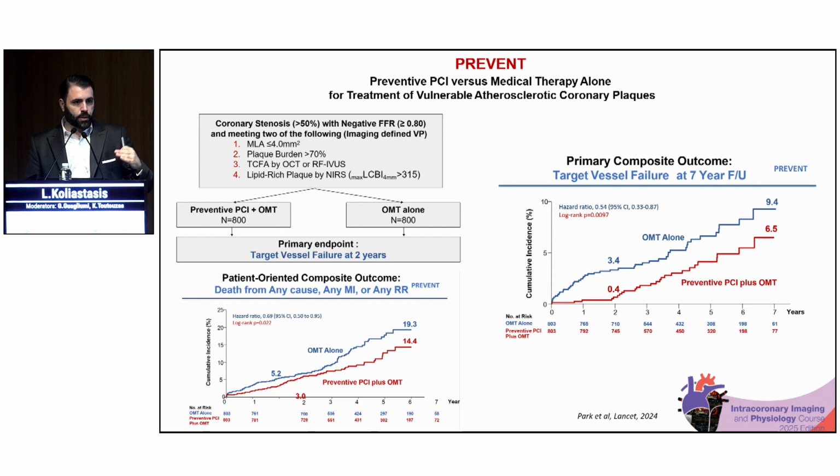Of course, we should keep in mind that almost half of the patients were treated with the Absorb platform, the bioresorbable Absorb platform that was removed from the market in the middle of the trial, and that's why the investigators changed to drug-eluting stents after the removal of the Absorb platforms.